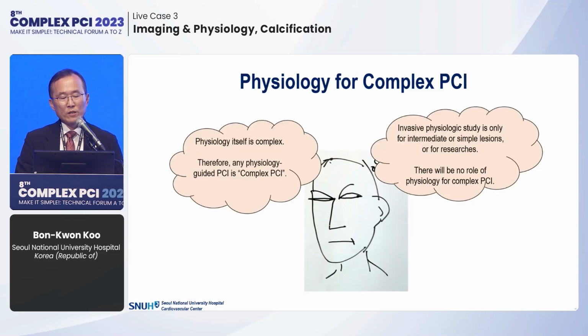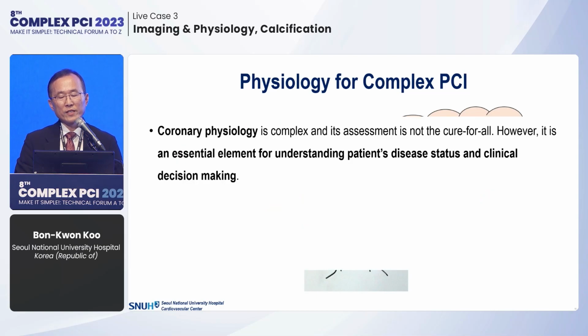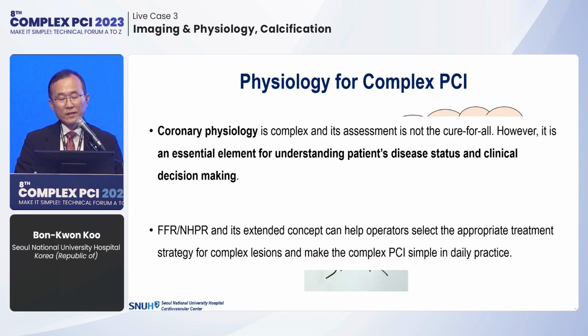So I started my talk with a kind of skepticism about the concept of physiology for complex PCI, but I hope that now you think that physiology is an essential element for understanding patient disease status and clinical decision making, and it can help to select the appropriate treatment strategy and sometimes make complex PCI simple in daily practice. Thank you very much for your kind attention.